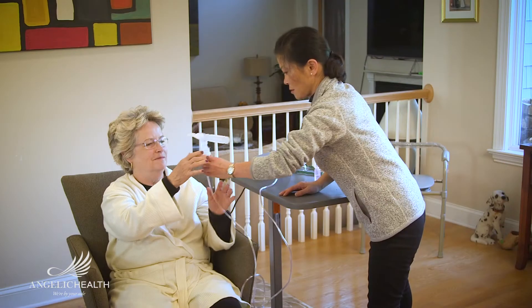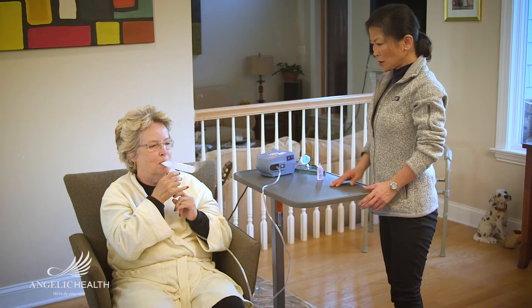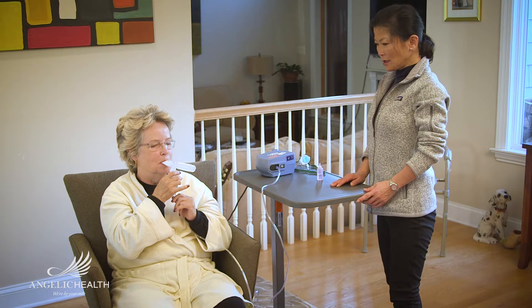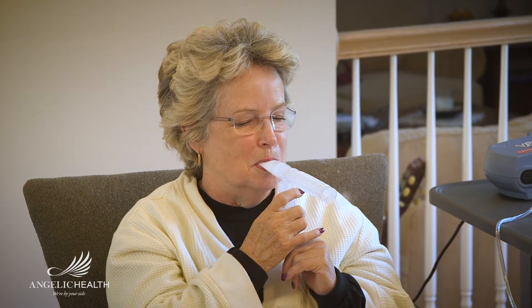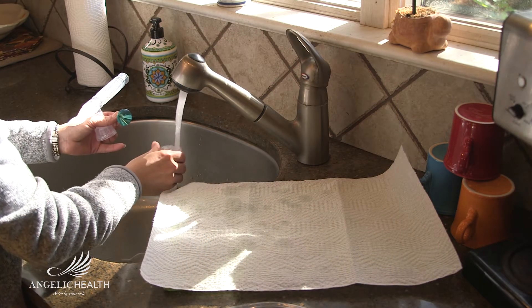Place the mask over the patient's nose and mouth. If using a mouthpiece, put it in the patient's mouth. Lips should be firm around the mouthpiece so that all the medicine goes into the lungs. The patient must breathe through their mouth until the medicine is used. This takes 10 to 15 minutes. Turn off the machine when done.